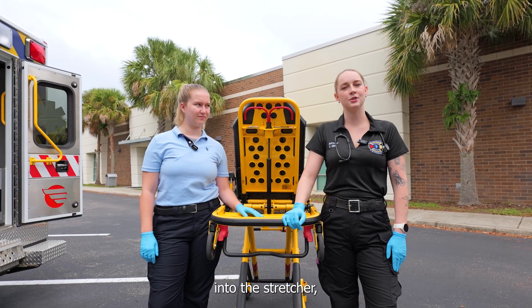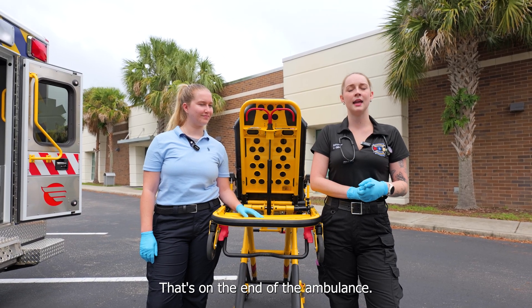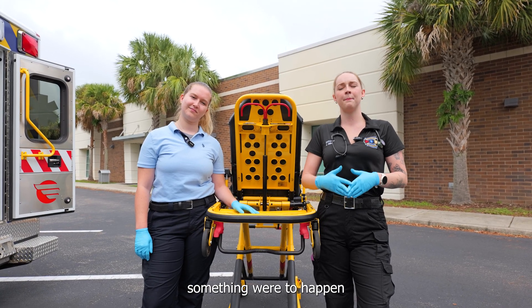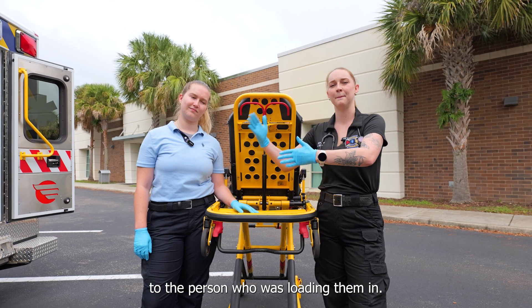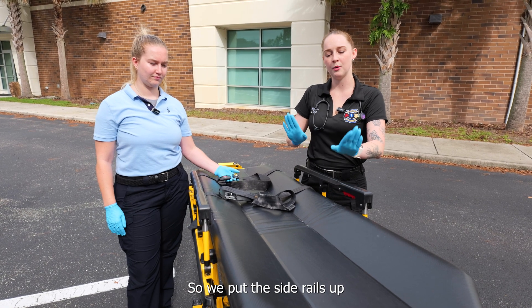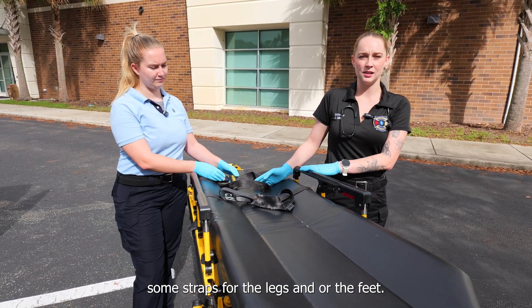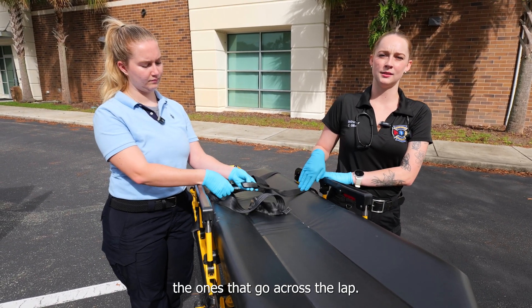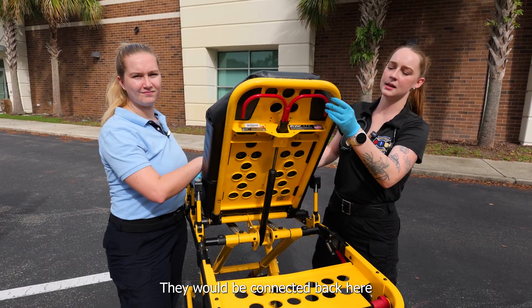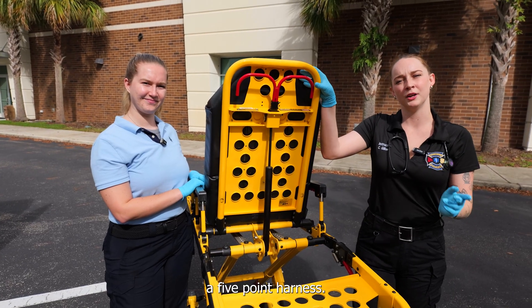When we load the patient into the stretcher, we want to make sure that this black bar here connects to the hook that's on the end of the ambulance. This makes sure that the stretcher doesn't fall out in the event something were to happen to the person loading them in — just keeps everyone nice and safe. When we put our patients on the stretcher, we make sure they're secure: side rails up and seatbelts on. Typically there are straps for the legs and feet, ones that go across the lap, and sometimes stretcher straps that connect in the back and come up and around to give our patient a five-point harness.